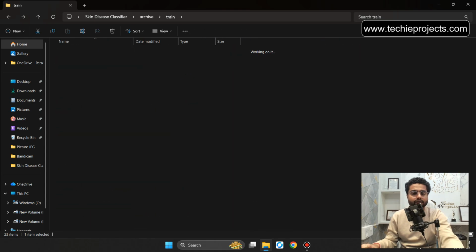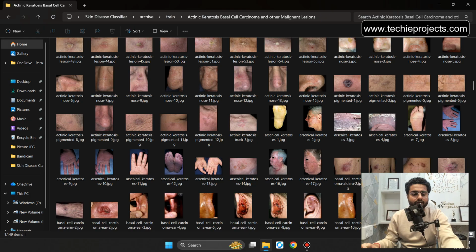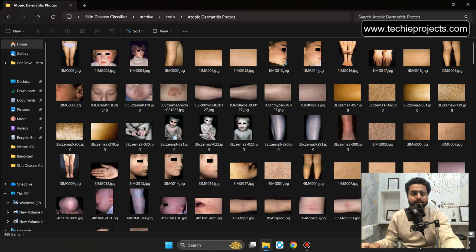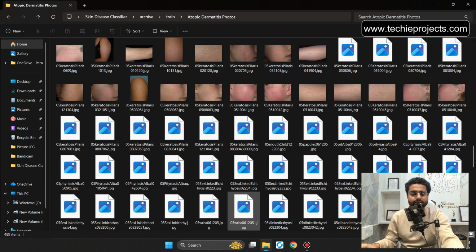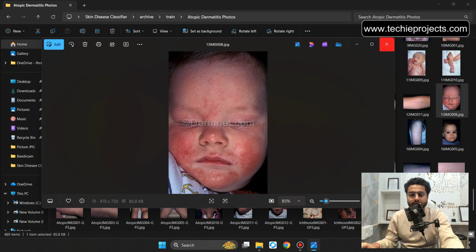And the second folder, it will be around 1149 images. Let's scroll down. So we have to train the model on those particular images of the dataset. This is atopic dermatitis photos. It will be around 489 items. We have to train the model from those particular images, and then the system can identify that particular disease.